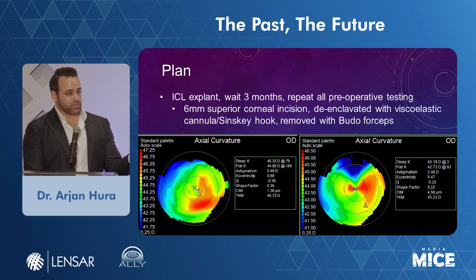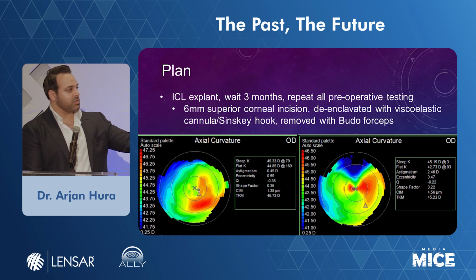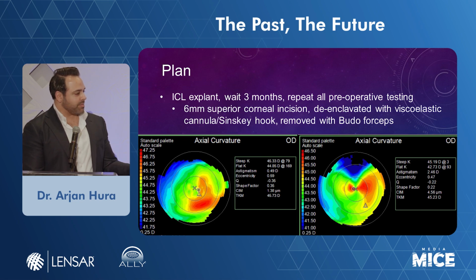I put 3 corneal sutures in, took them out 1 month later, and then you can see the difference in topography here between the time before surgery and after surgery. Notice I've induced 2 diopters of corneal astigmatism. So let me turn it back to the panel now.